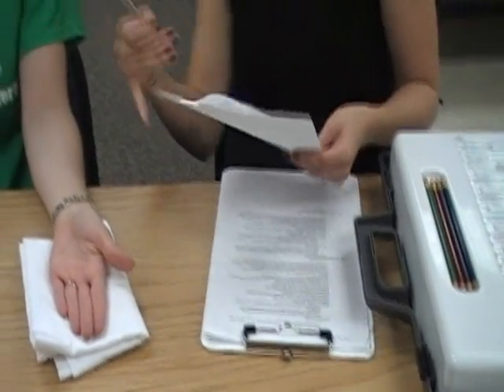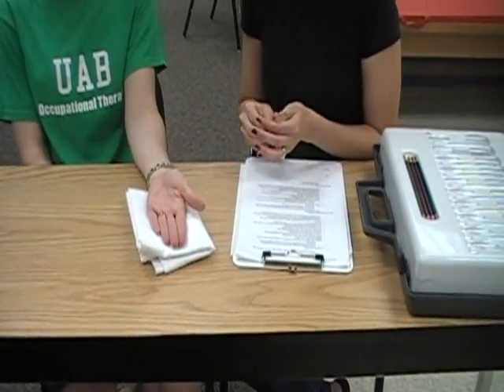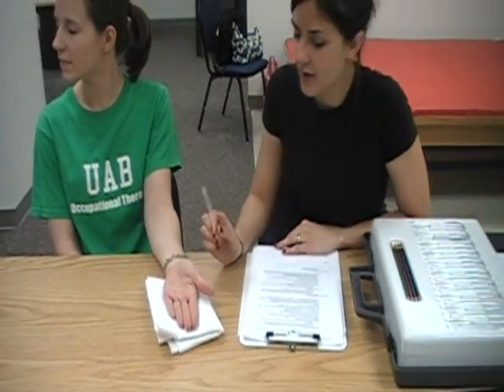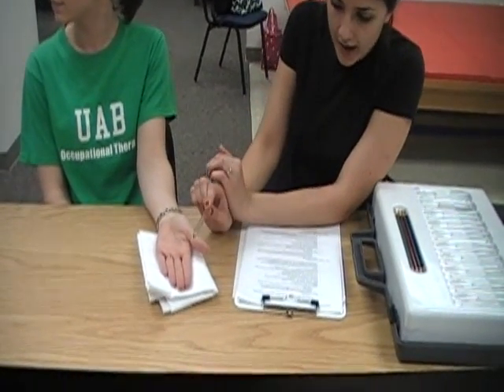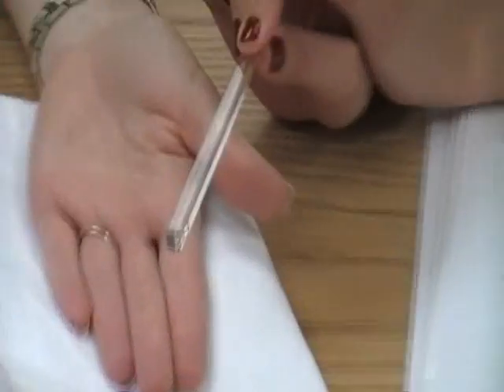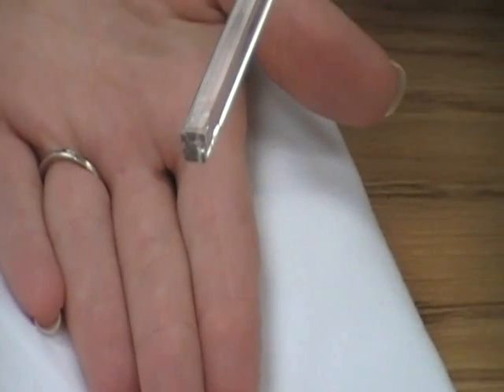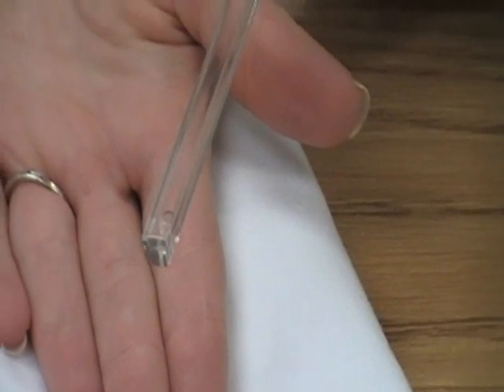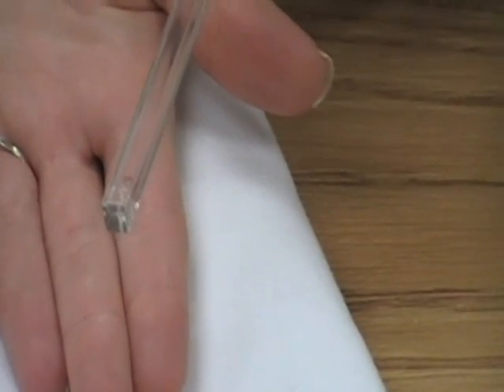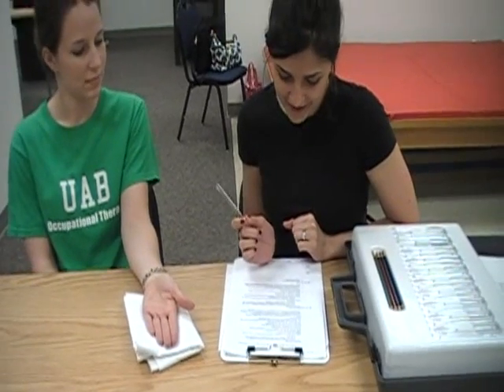Amy, please look away and just say 'touch' when you feel the monofilament touching you. You want to make sure you aren't touching the client — just push down until the monofilament bends a little bit. Let me know when you can feel it. Touch. Okay. You would then color in which monofilament she could feel, and that's the gist of it.